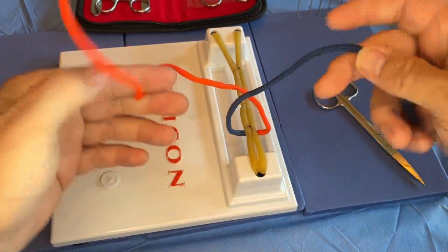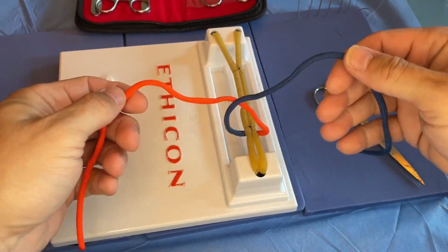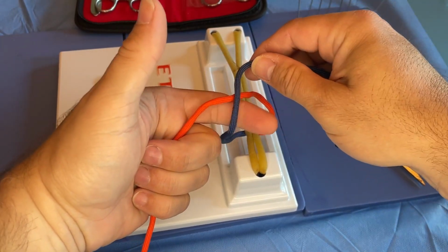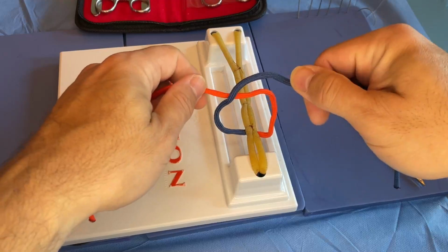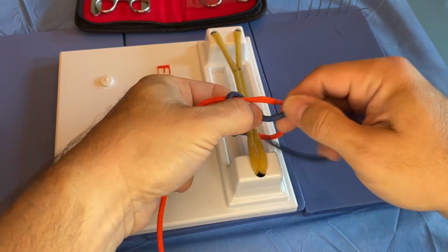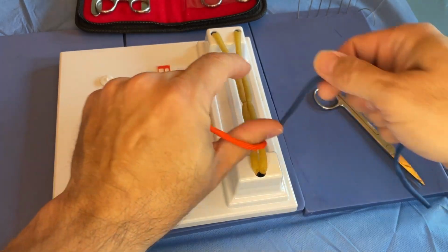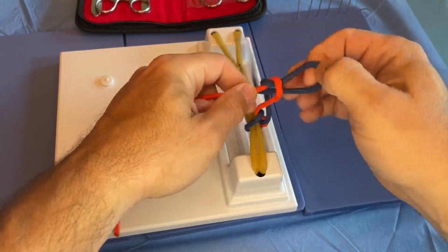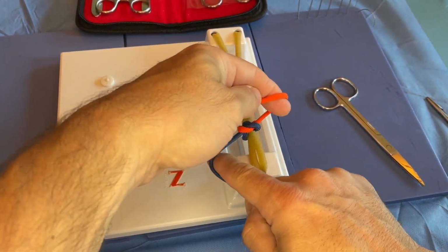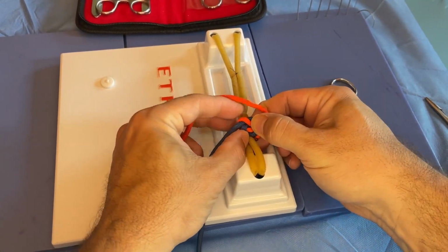But here we'll say we've got two free ends, a free tie, no needle on it, so we can cross it over, no instruments here, and then start with finger. So again, we're looping over the finger. We've already got our loop kind of created for us there. Loop it over the finger, pinch, swing through, grab the blue, bring it through, and there's our first. Since we did that first one over finger, now we're going to come over thumb, pinch, swing it through. I still find that I have to pull oppositely like that. And again, there's our nice true square knot.